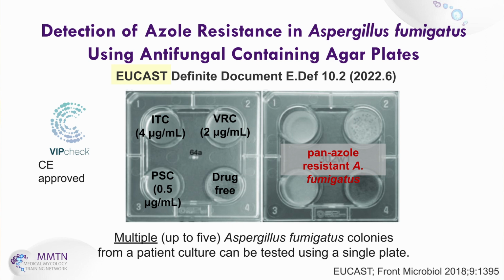So far, there is a CE-approved azole-agar screening assay. VIPcheck is commercially available. VIP here stands for voriconazole, itraconazole, and posaconazole.